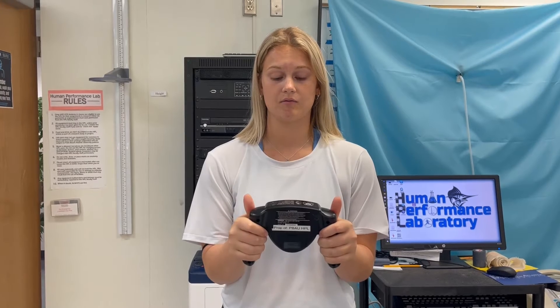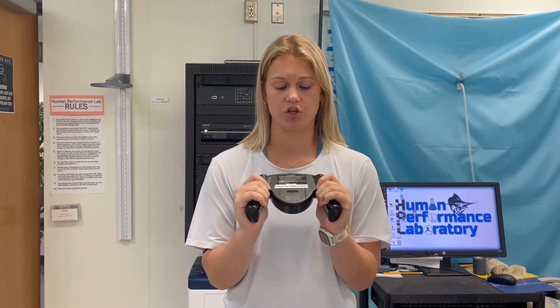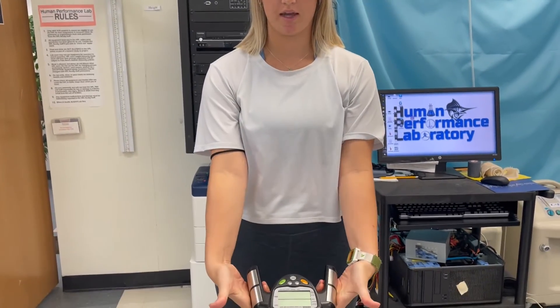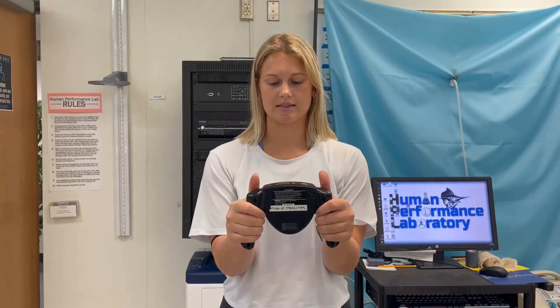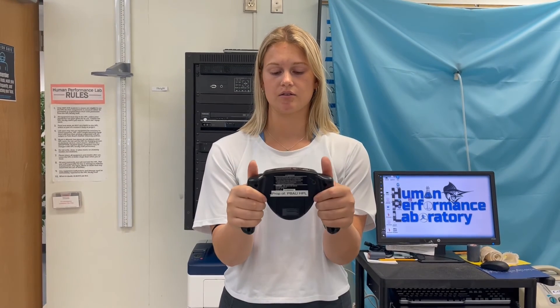Once the monitor is calibrated, have your subject hold the monitor with their fingers around the ridges, thumbs pointed up, and palms completely covering the electrodes. Once this position is acquired, press the green start button and do the test.